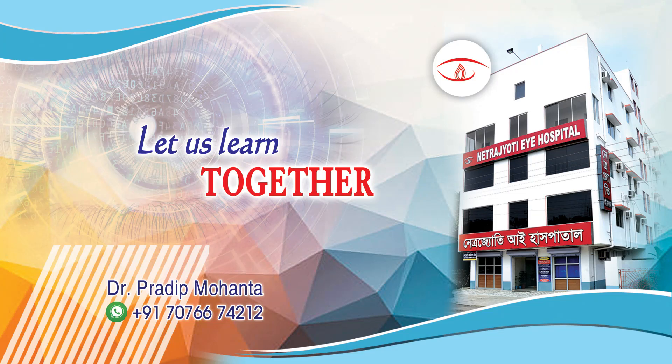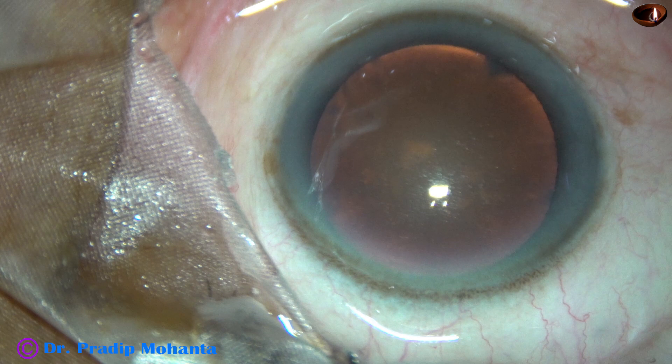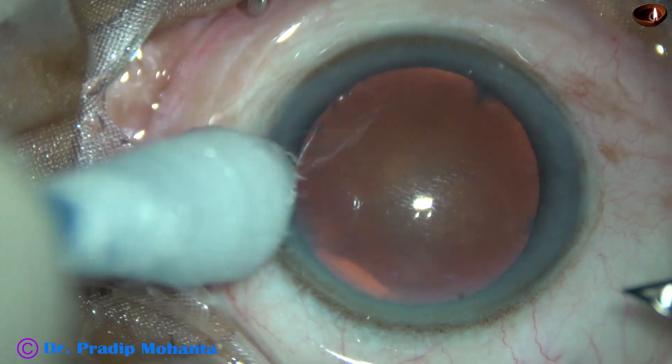Friends, welcome to my workplace at Ranaghat, West Bengal, India. This is a cataract with grade 2 nucleus sclerosis. Let us observe this surgery.